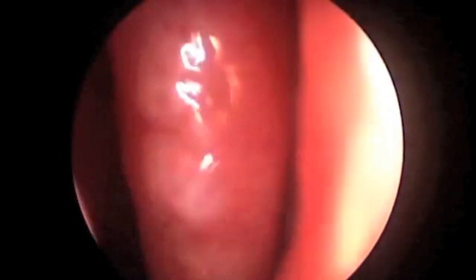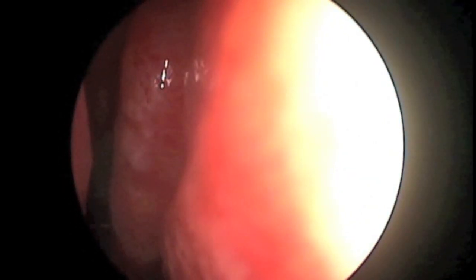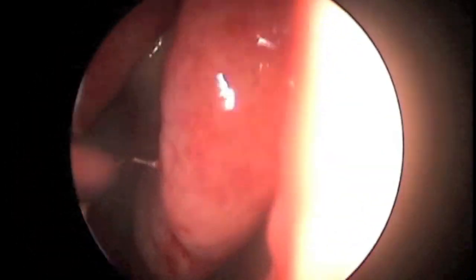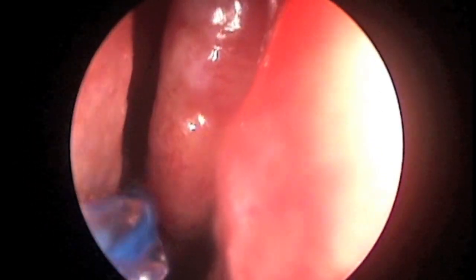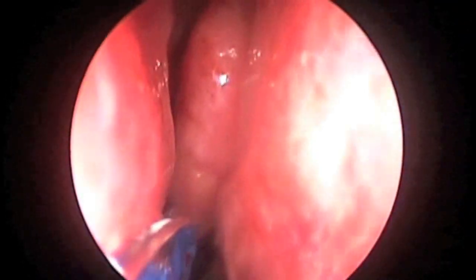Once you palpate or feel the opening, the balloon is slid over to the malleable tip and then inflated. Here we see the two centimeter mark. The balloon is being slid to the malleable tip and then it will be inflated.